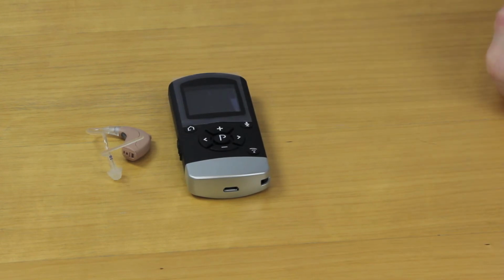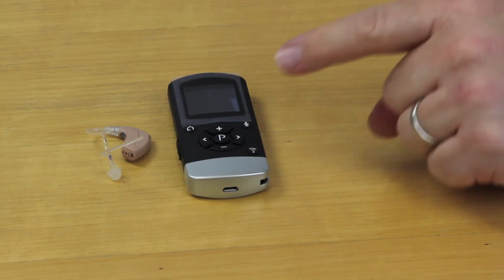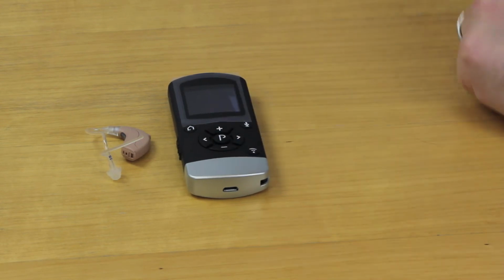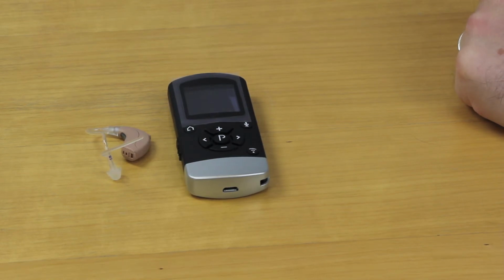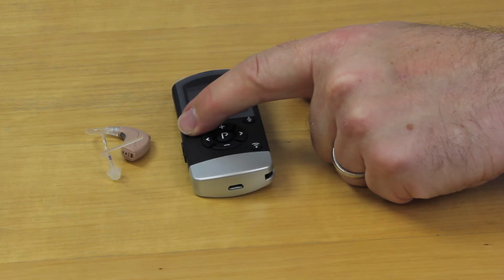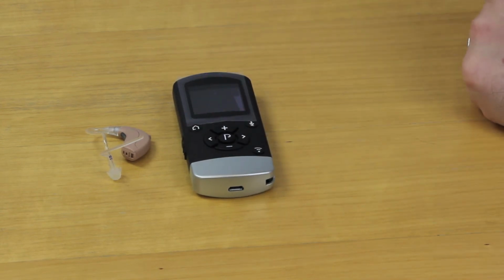To change programs, press the P button. Each button press will be accompanied by the corresponding number of beeps for the selected program in your hearing aids. To go back to Home Settings, press the Home button. This will reset volume to default, as well as turn the hearing aids back to Program 1.